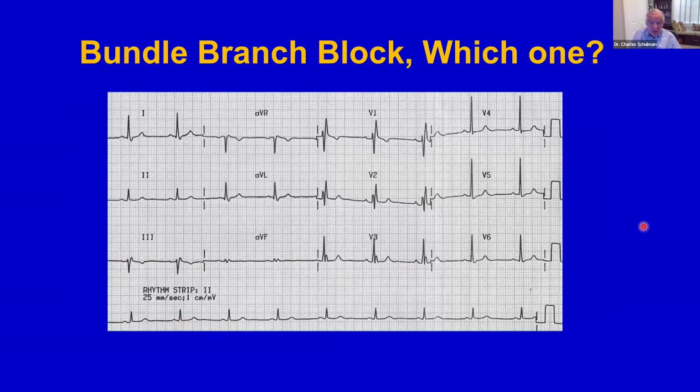So here we go. Sinus rhythm with bundle branch block. Which one, left or right? Put your answer in the chat. The answer is right. This is right bundle branch block.